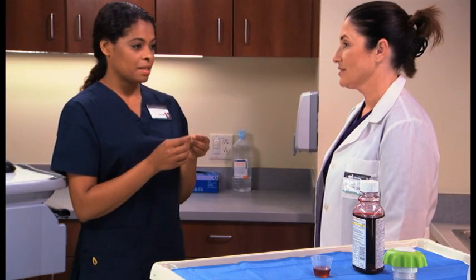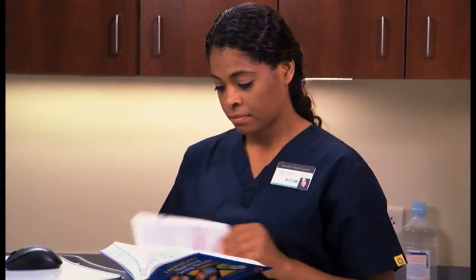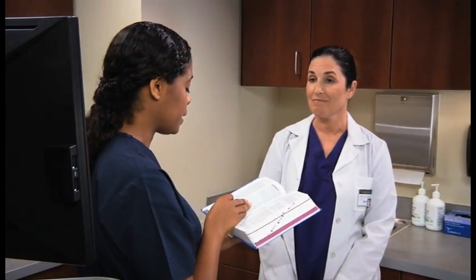Oh, Ms. Thomas, this is a tablet. Well, what modification should we make for a tablet since we're administering via a gastrostomy tube? I can check to see if it can be crushed safely, right? Right. Let's look at our medication reference to see if it can be crushed. It can be crushed and mixed with water, which would be appropriate for putting through the tube, right?